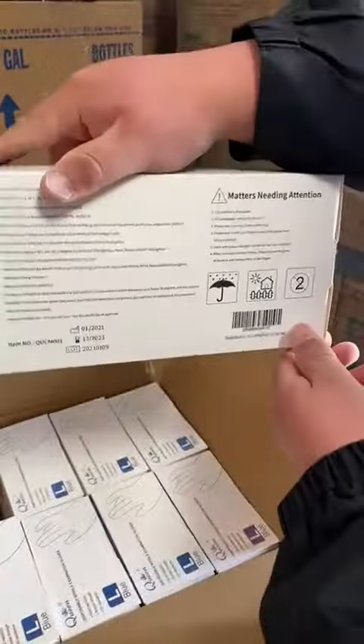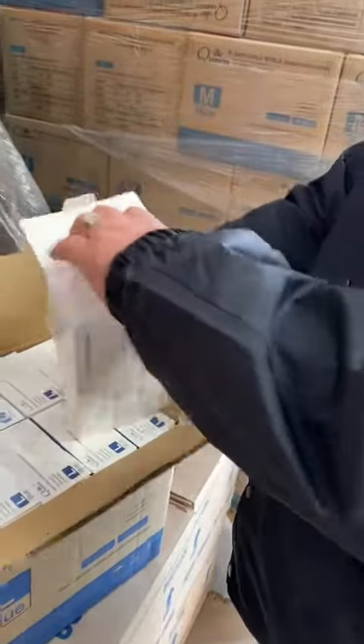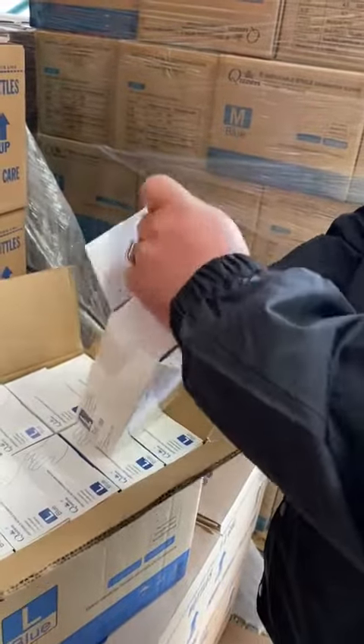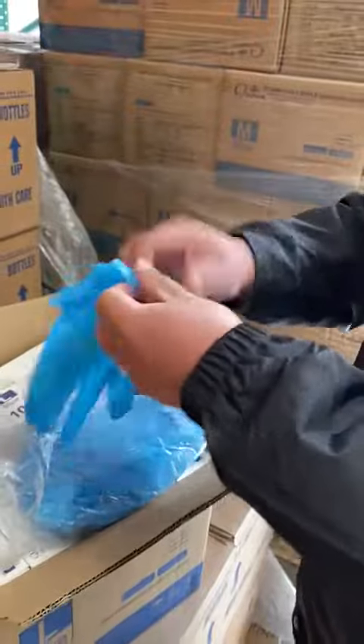All right, here you go — open, 100 per box. This is a large, so you can see as I put it on the right way. So here you go, that's a large.